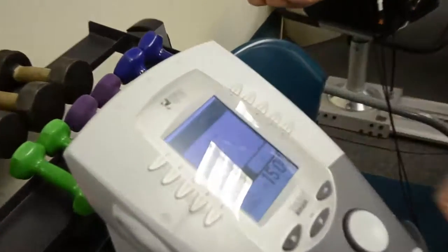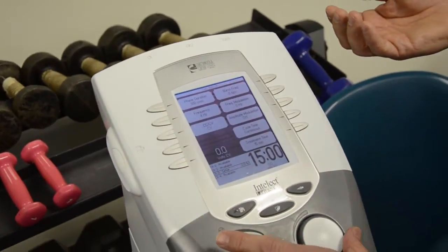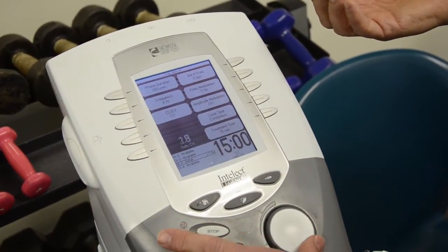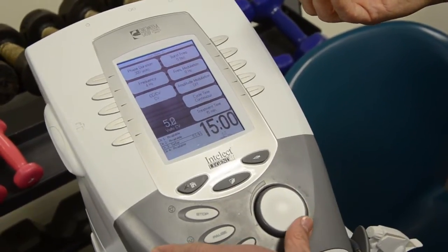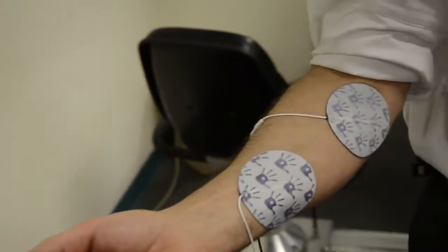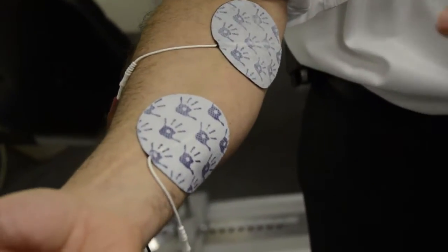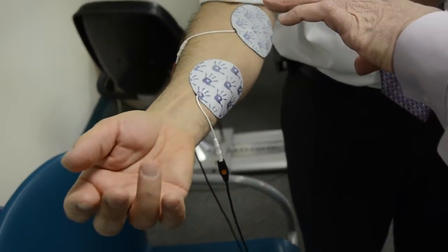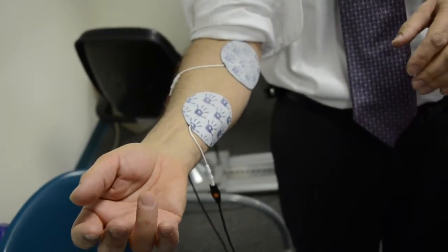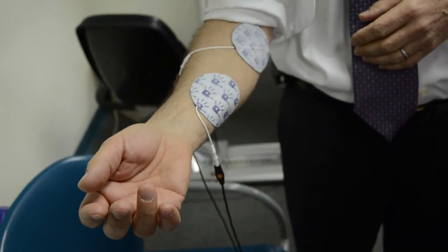I'm going to do this in a pulsing mode because it's more dramatic — you can see muscle twitching. You can tell me as you start feeling something. I feel a little something now... a little tingle... whoa, whoa, whoa. The machine has taken over your hand. And depending where we position it — I won't do this during surgery. I could crank that up and make a much stronger contraction.